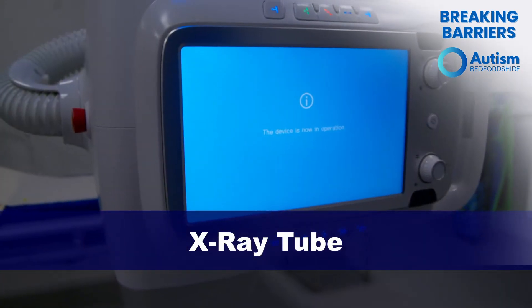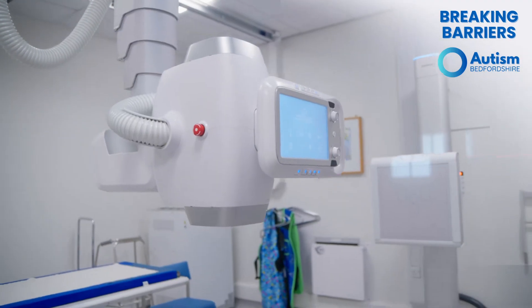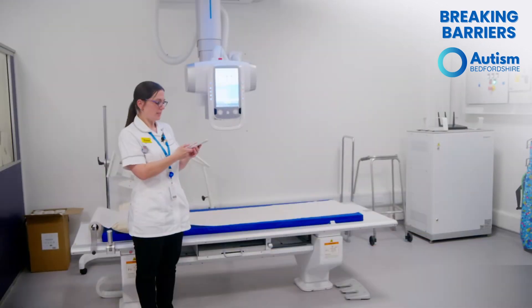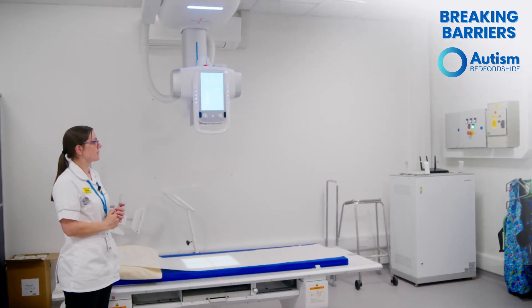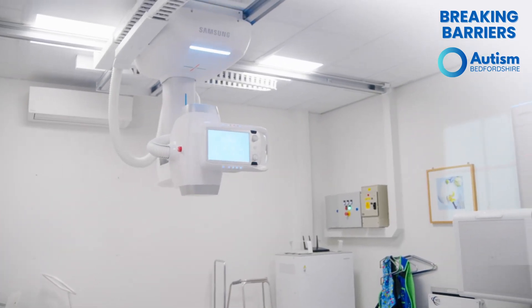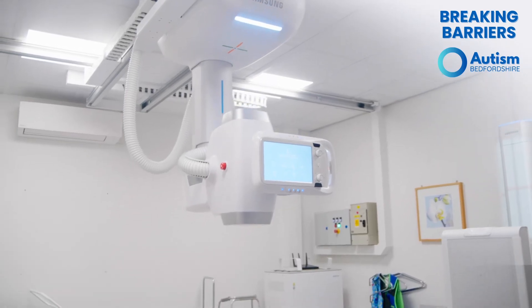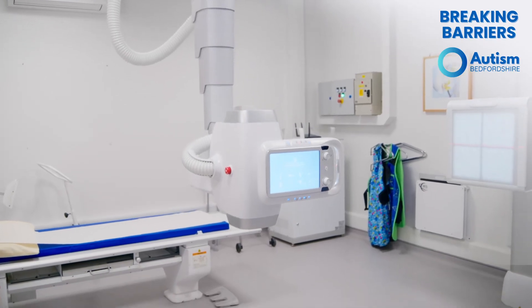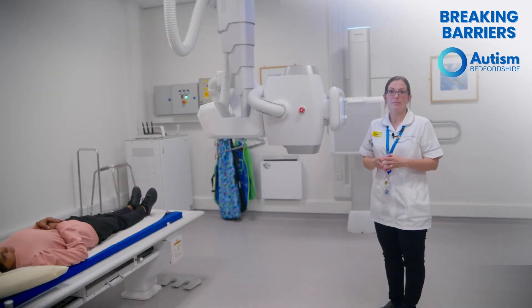This is what we call the x-ray tube, and this is what takes the x-ray. The tube can move around the room by using a remote control — this is how it moves and these are the noises it makes. The tube can also be moved by the radiographer by hand.